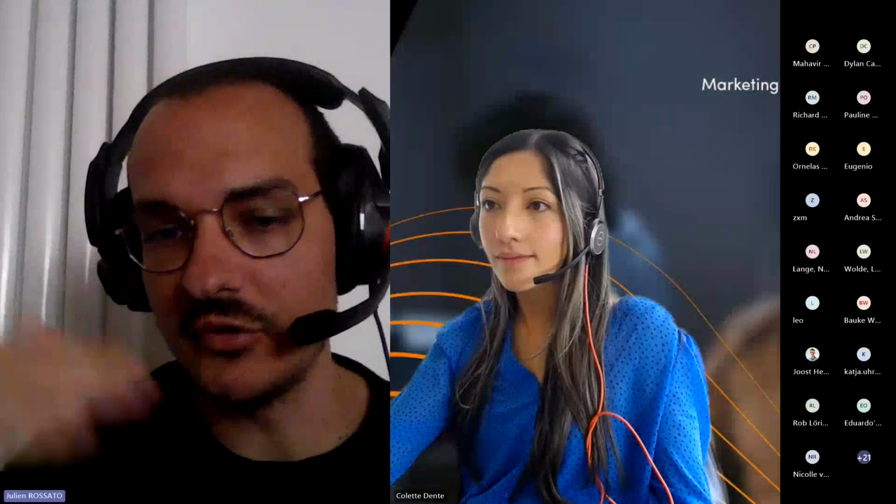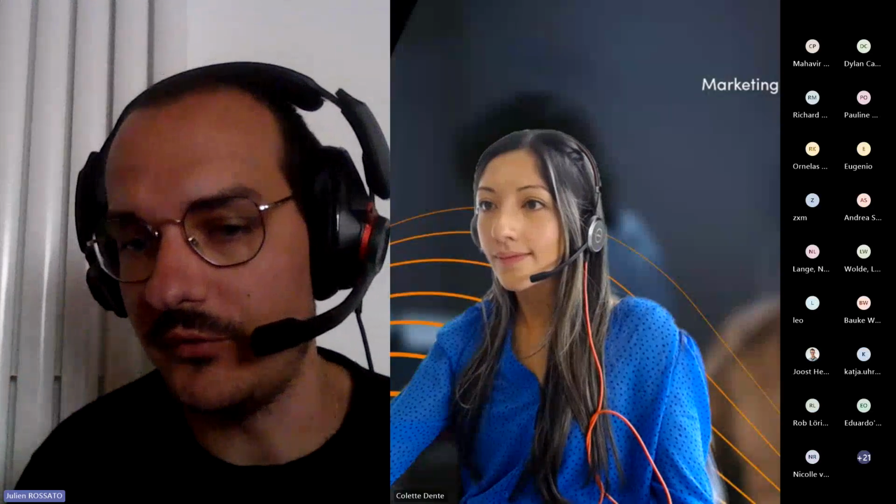You saw it in my presentation. So by doing so, you will be able to build a good library of all the motor units, the smallest ones because you identify them with small contractions, and the biggest ones. And so yes, indeed, you will not have the same motor unit if you change your force production. I hope it answered the question.